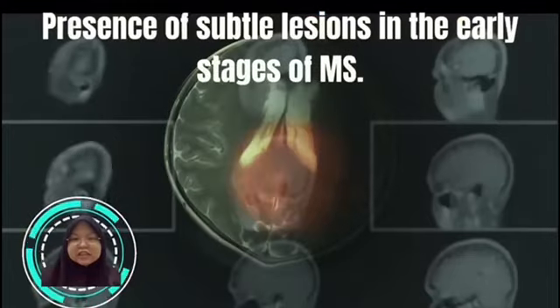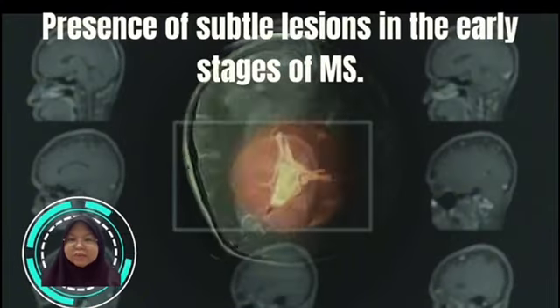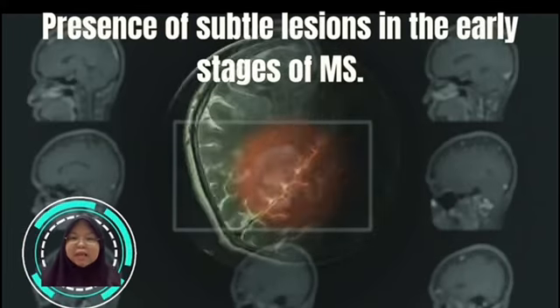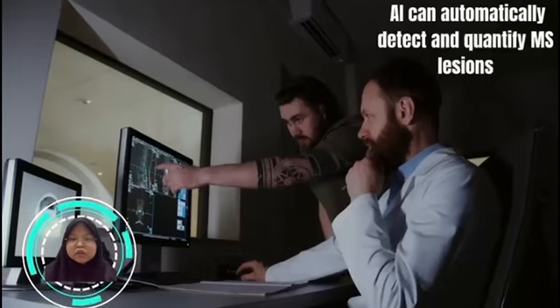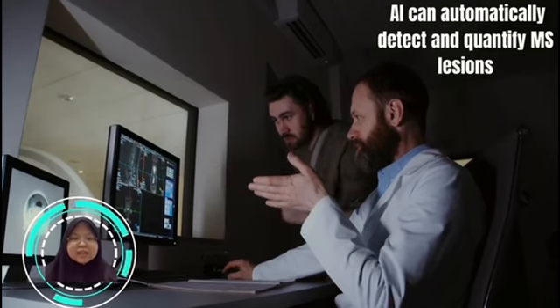The challenge is the presence of subtle lesions in the early stage of multiple sclerosis. The lesions may be small, diffuse, or located in anatomically complex areas such as the brainstem or spinal cord, where they are difficult to visualize clearly on a standard MRI sequence. This is further compounded by the increasing workload of radiologists worldwide. There is a growing shortage of trained neuroradiologists, while MRI demands continue to rise. This heavy workload increases the risk of fatigue-related error or misfinding, especially in subtle cases.